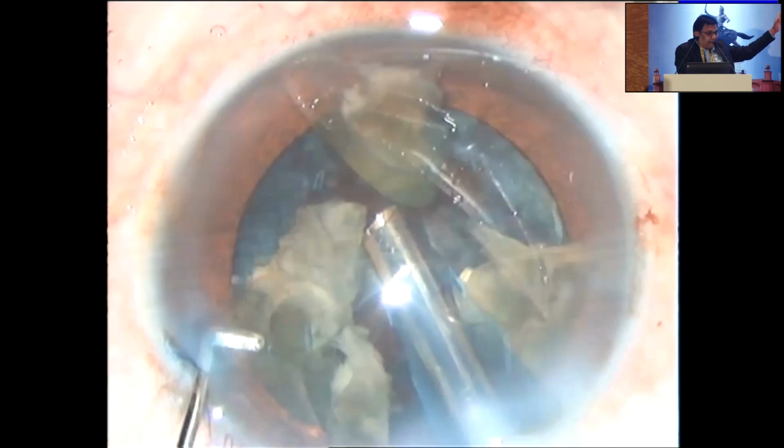Can anybody tell why the pieces are not coming easily? Because this is the base of the phaco fluidics. Can anyone tell? Yes, one point is the occlusion. Second?